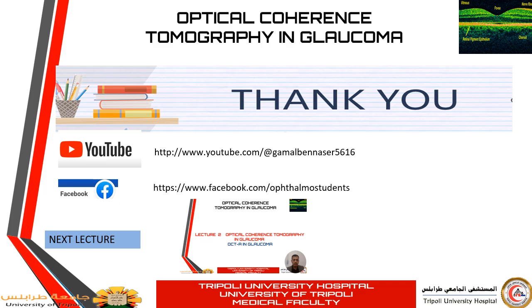We tried to cover many aspects regarding the definition of glaucoma, the introduction of the different types of OCT available in the market, the principles of artifacts, the principles of interpreting the OCT maps, and certain important points related to the subject. The next part, part 2 of the same lecture regarding interpretation of OCT, will concentrate on OCT angiography and the recent advances in glaucoma imaging techniques.